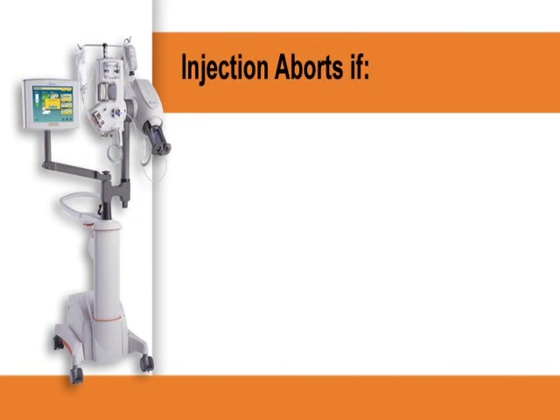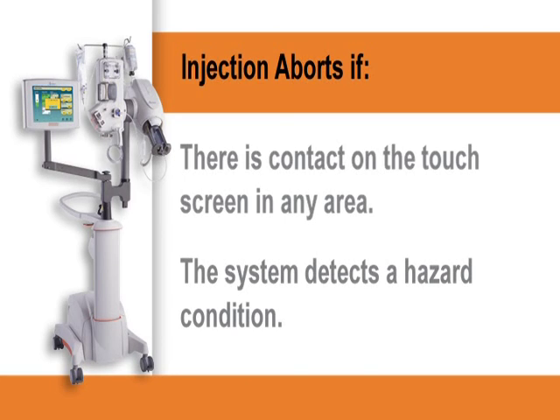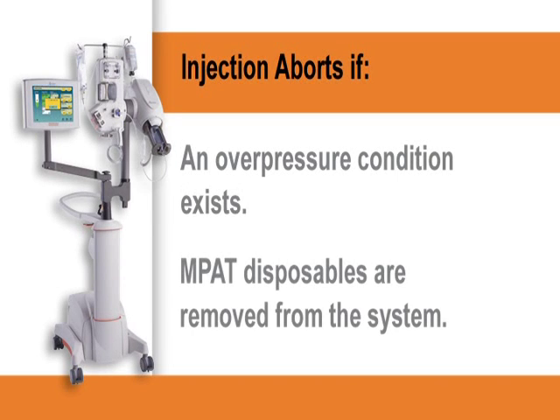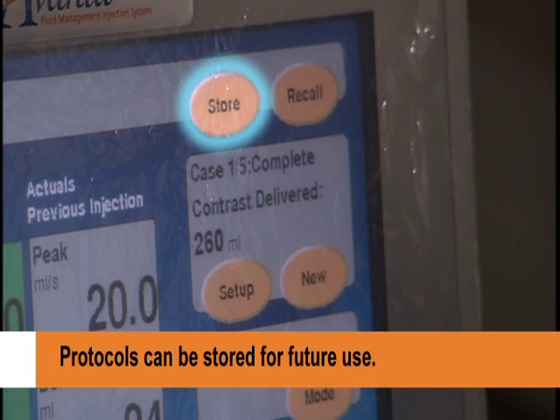The injection will abort if there is contact on the touchscreen in any area when injecting, the system detects a hazard condition, an overpressure condition exists, or if MPAT disposables are removed from the system. Once an injection is complete, you may save the protocol in the system memory for future use.